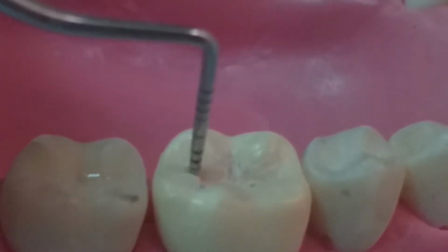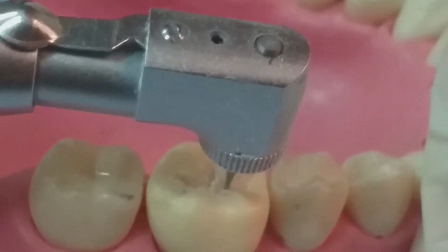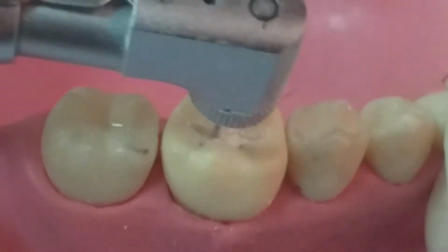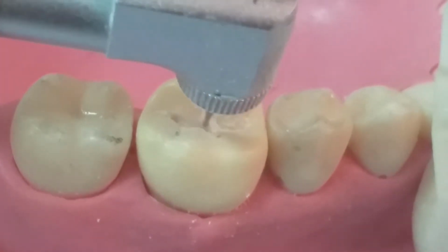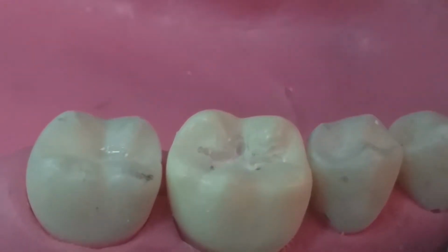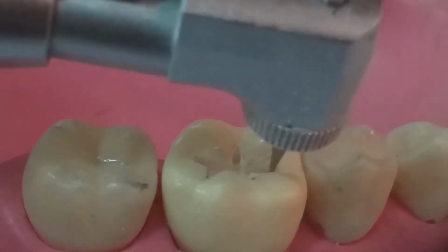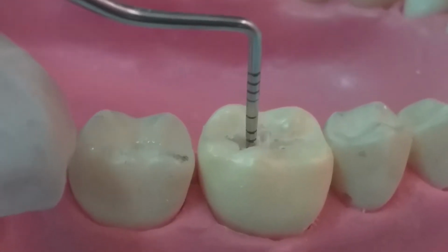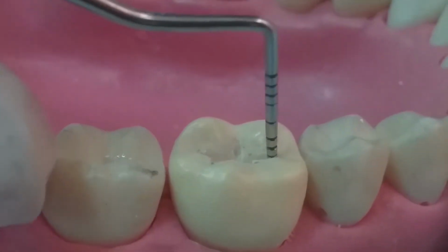Continuing our preparation, and here we are using our probe to determine the depths, and as we saw, it's the ideal one, but needs some finish, small preparation to make the ideal depth 1.5 millimeter.